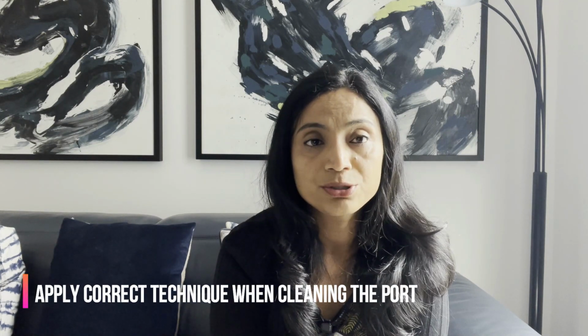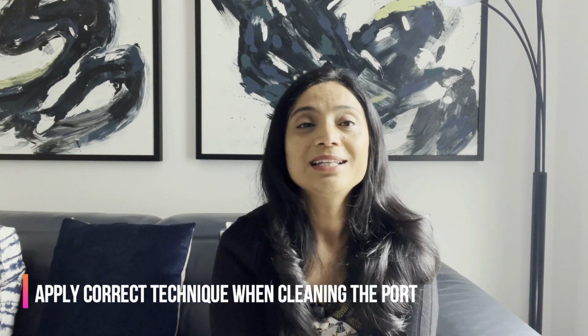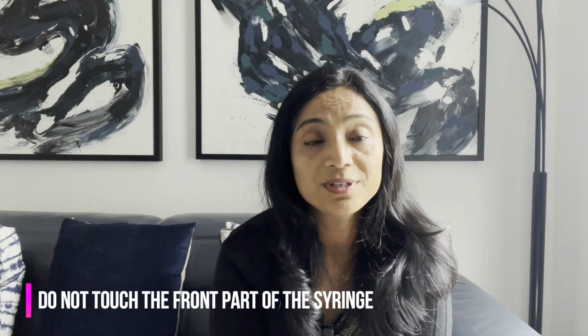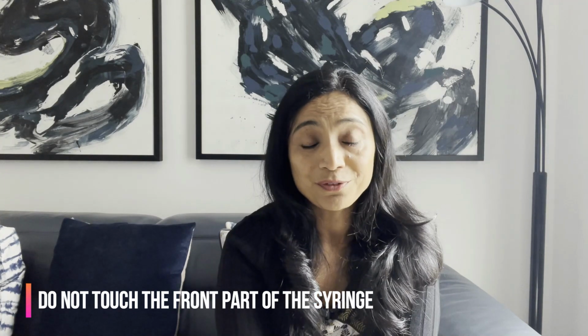So now my top tips for this station. The first top tip is make sure that your technique of cleaning the port is correct. You're going to clean it in one swipe motion. You're not going to go backwards on yourself. Once you clean it with one swipe motion for 30 seconds, let it dry for 30 seconds. Please don't put your gloved hand or anything on it again, because then you will contaminate the port again. Another top tip is that you obviously don't touch the key part of the syringe, which is the front of the syringe, at any point, because that will contaminate your sample.